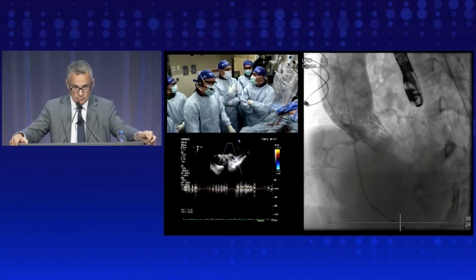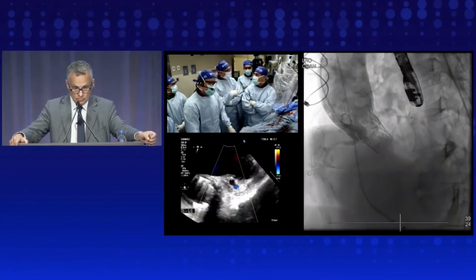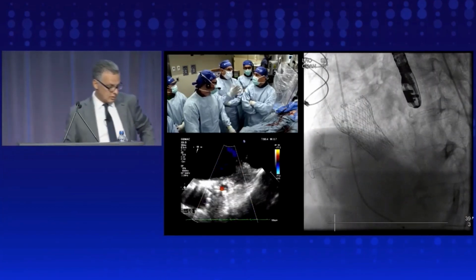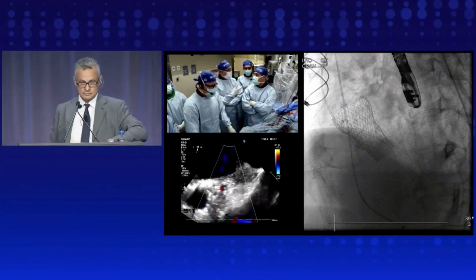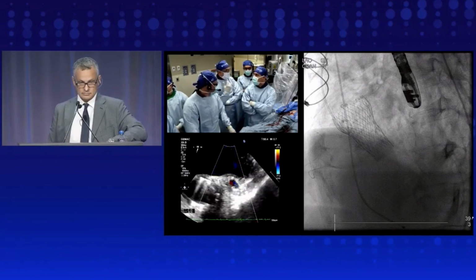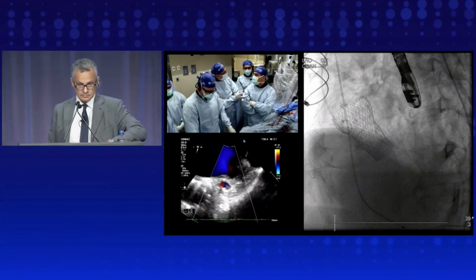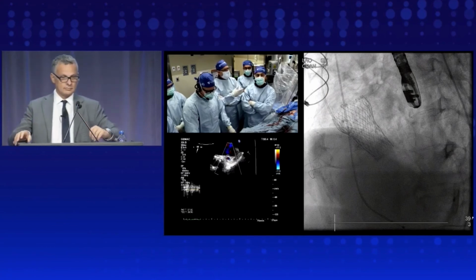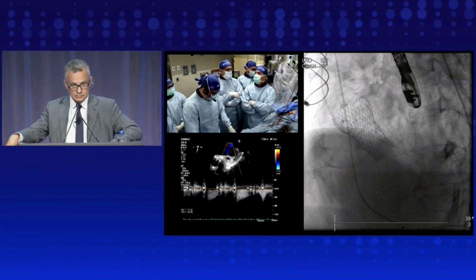But in terms of actual complications from the tearing or the laceration, we really have not seen anything at this particular juncture. And then that cutoff, it's usually black or white, but there is just a gray zone. I think Gabriel, and Danny and Jamie as well, have been doing TAVR for almost 10 years now, and in the last year we've done 35 Basilicas. About 35. So it's really interesting. We hadn't done one for almost a decade, and all of a sudden we have all these cases. But it's good to have it in the armamentarium.